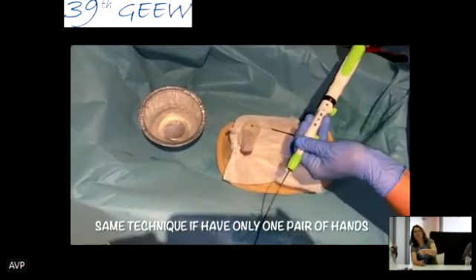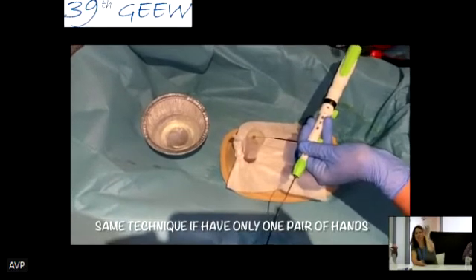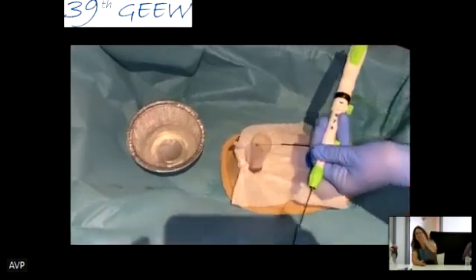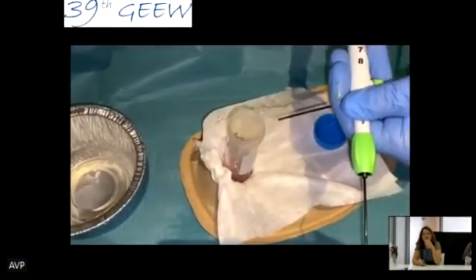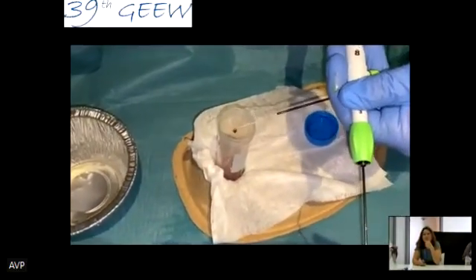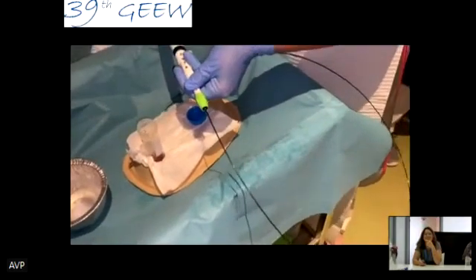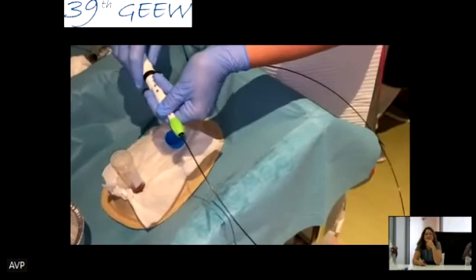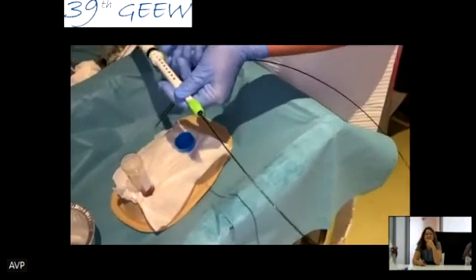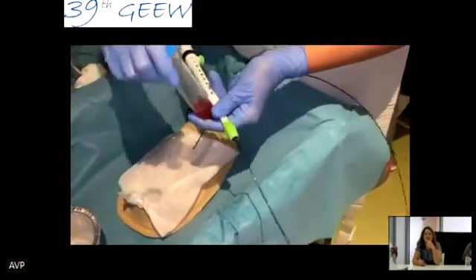So the loop, as you saw here, pushing in the guide wire, and you have a system to make a little hole in the carton there, so nobody has to hold it. Good trick, huh? And then we bring back the needle, and it's ready also to go to the pathologist.